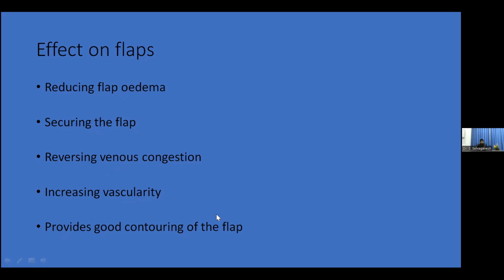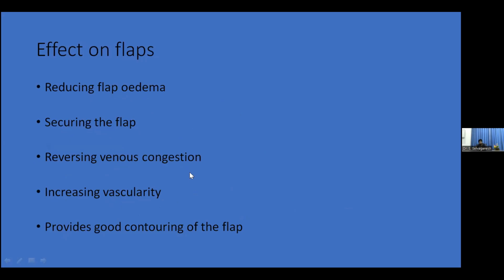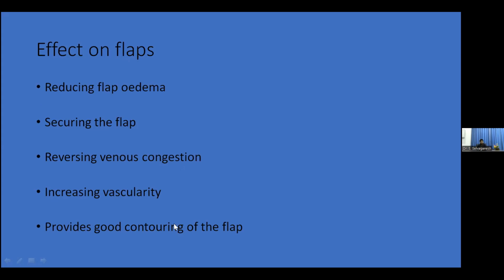Lastly, I think it provides anchorage to the graft and flap, so it keeps it in place, basically a bolster.